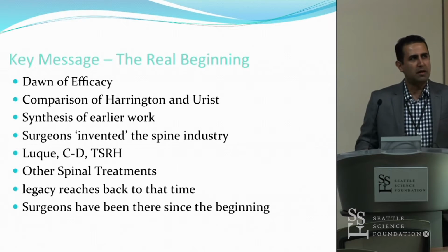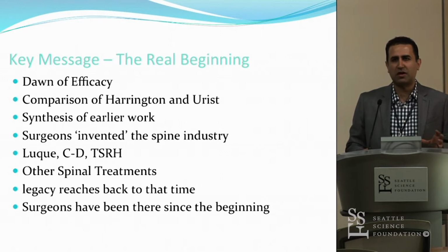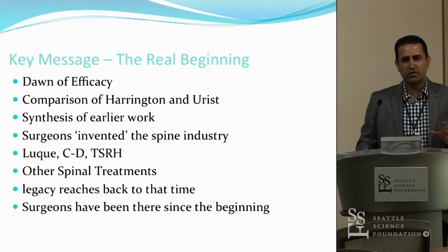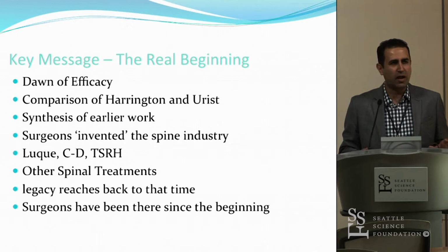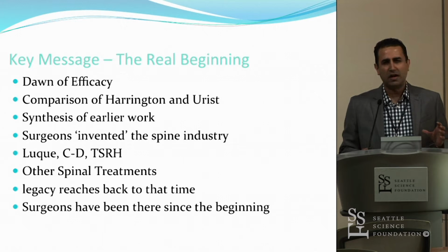But the importance here is to recognize that surgeons have been involved in instrumentation right from the very beginning. This is not something that came from industry and then we decided to modify it. Surgeons were the ones that had their elbows in the grease, designing fixation systems, sublaminar wires, rods, then screws, and then putting it to practical use.